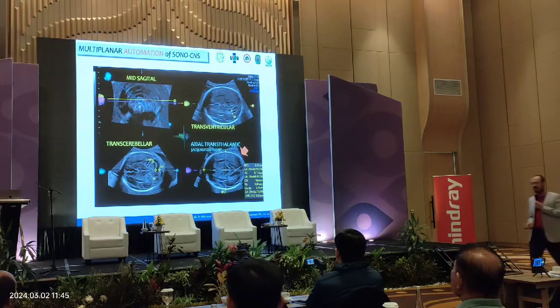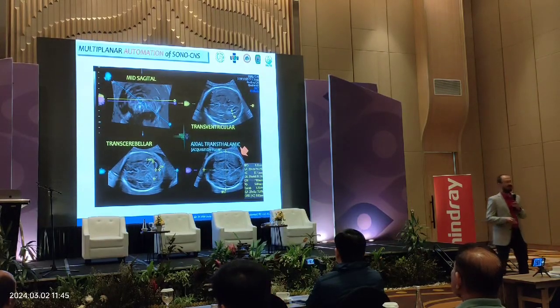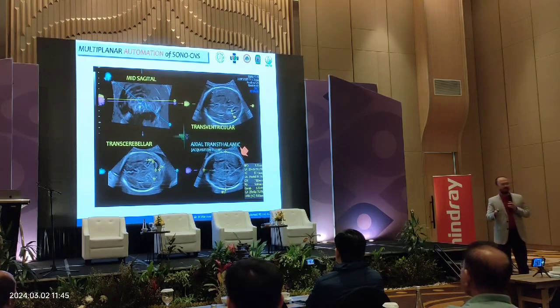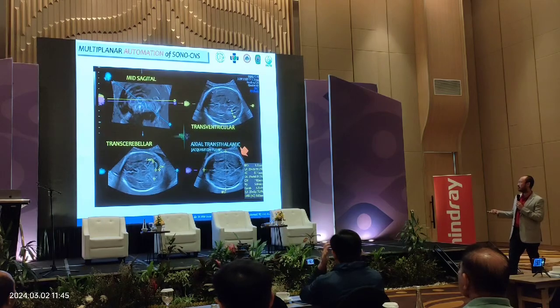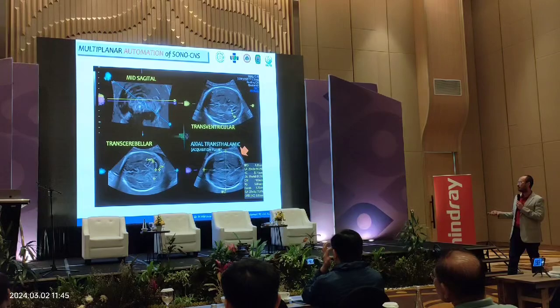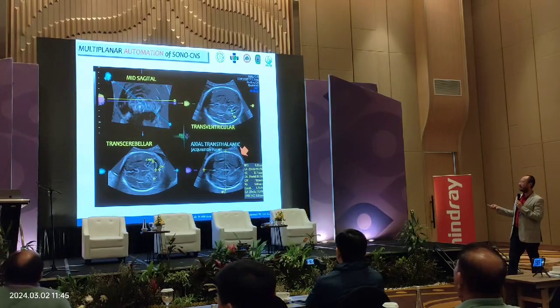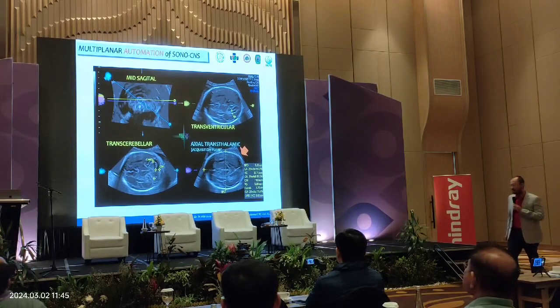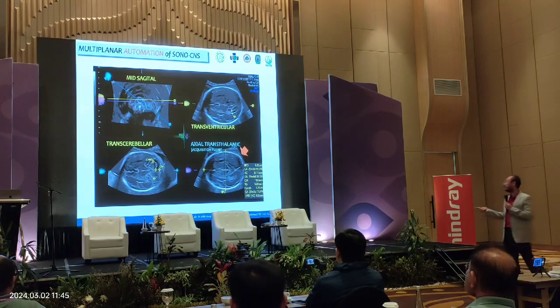So now the higher technology will make it easier to measure the compartments of the brain. The major compartments for measurement are the transcerebellar diameter, and the cisterna magna for the posterior complex, and for the lateral complex we can see the Sylvian region, and also the posterior horn of the lateral ventricle.